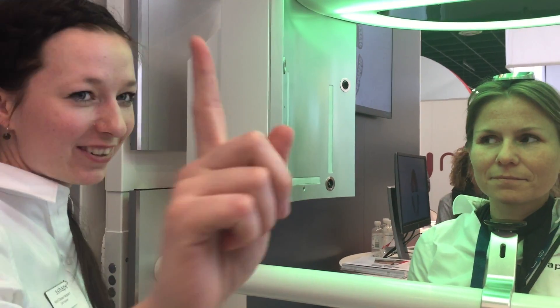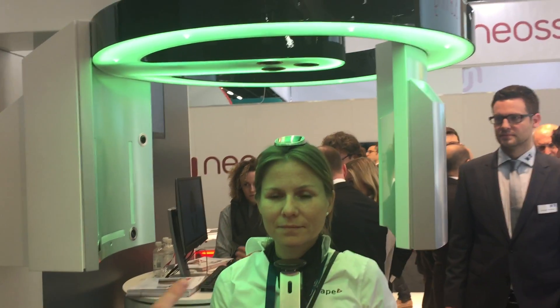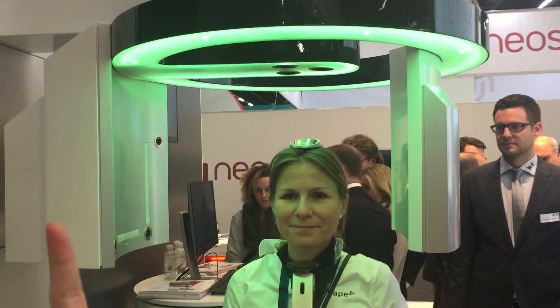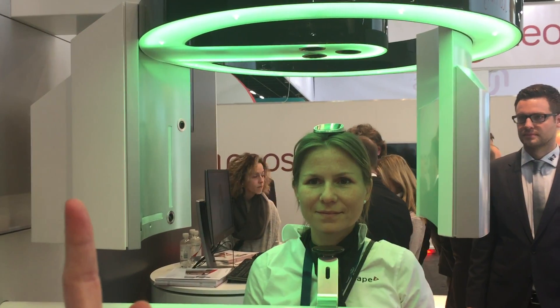And now you need to focus on my finger, and it's going to rotate around you. Try to keep focus. And I'm going to start the scan now.